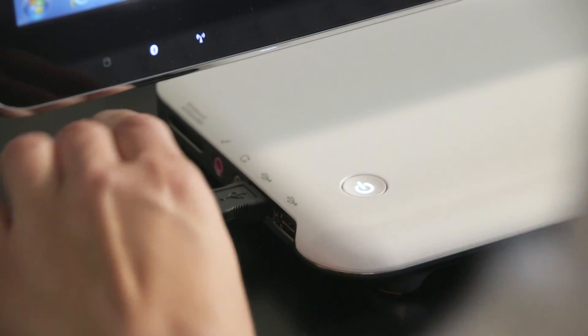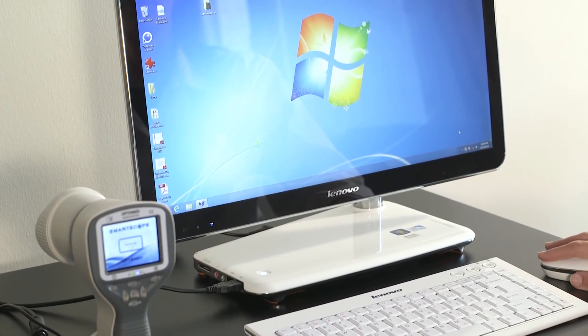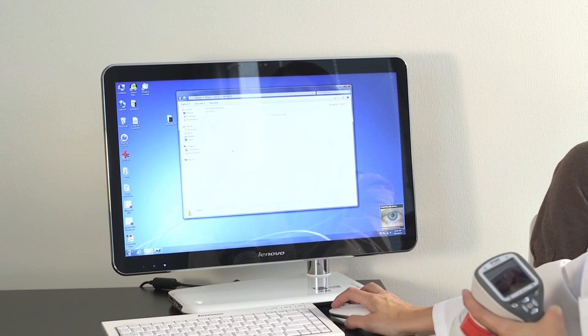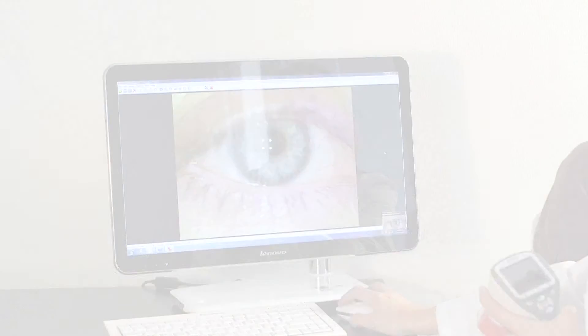Images are uploaded to the computer by placing the camera on the cradle. Image transfer works through USB connection in a similar way as with any other digital camera. It is also possible to transfer the images with Wi-Fi, as the taken image will wirelessly appear on the computer screen right after the image has been taken. If you need any help, please visit us at www.optomed.com/support.